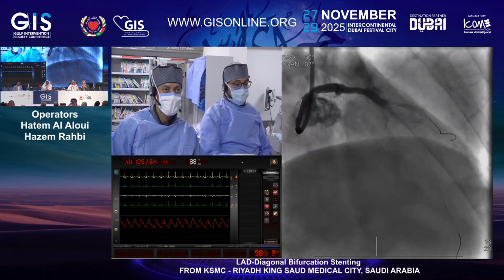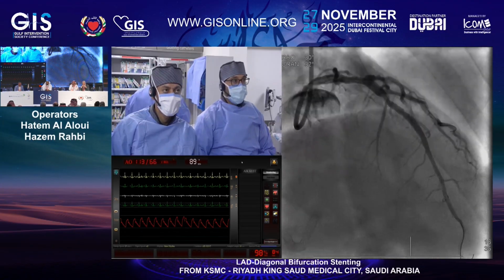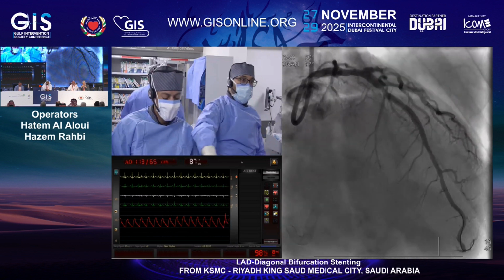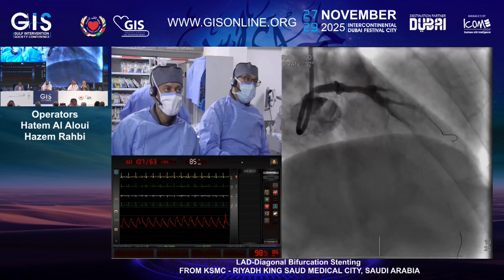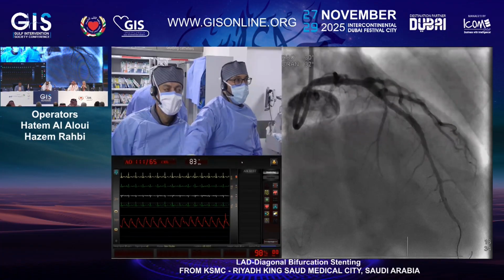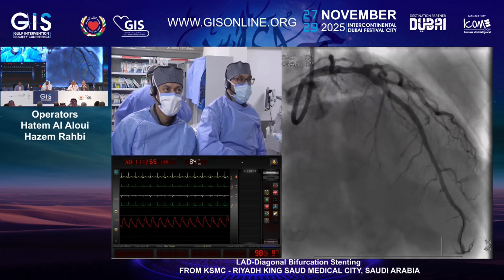But I don't think it's very tight, not angiographically and not on IVUS also. I fully agree. I'll go across the diagonal. You can see the result, and there is no harm to cover with minimal overlap if it really looks bad after the stenting, or we can follow the patient later on.